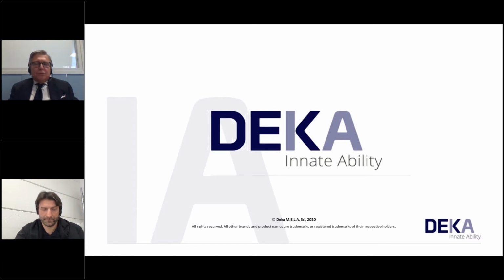So my suggestion is to use Onda before, wait 10 days, for example, and treat with the CO2, because our targets are different or only partially overlapping. With Onda, our target is the fat, and we recall back the heating from the depth, and we can tighten the skin in a sort of upside down thermal injury, because we recall back the energy and we tighten the skin.